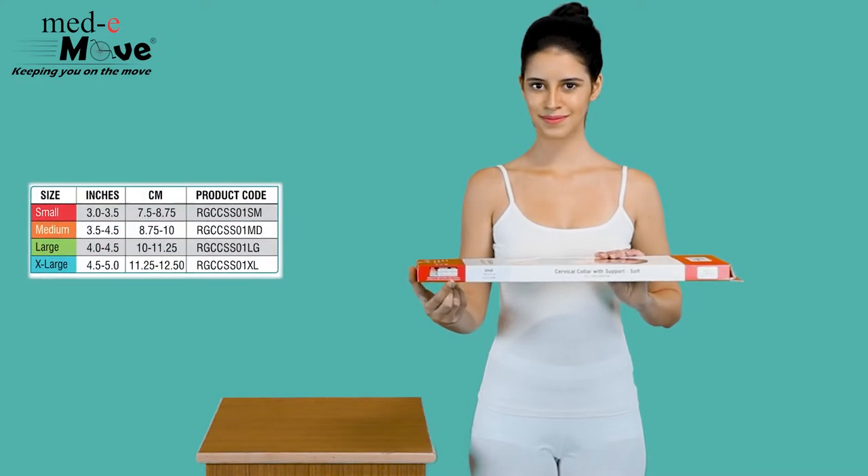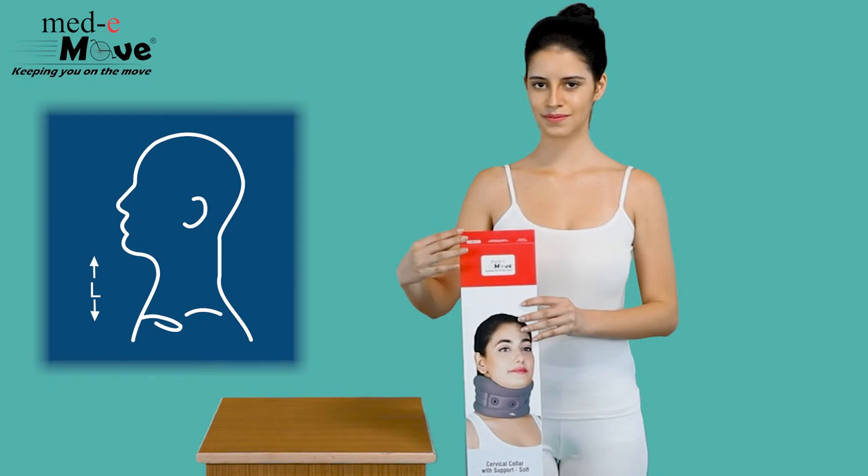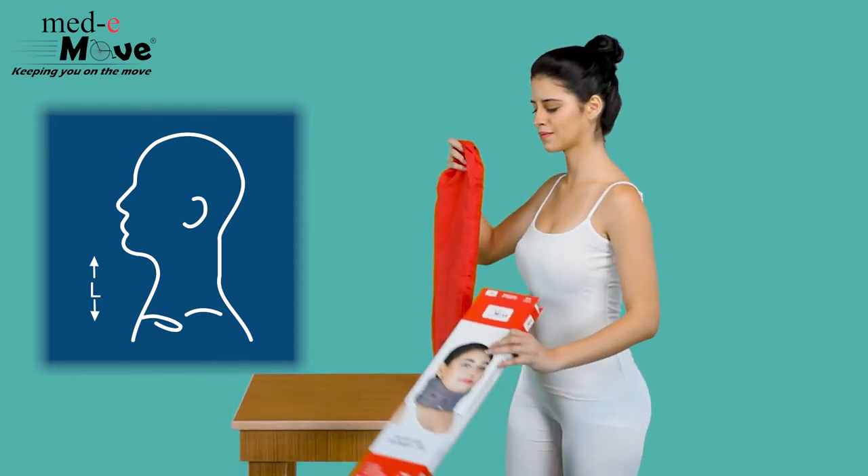The Medimove soft collar with support is available in 4 sizes. Measure the circumference around the neck below the lower jaw and then refer to the chart printed on the box.